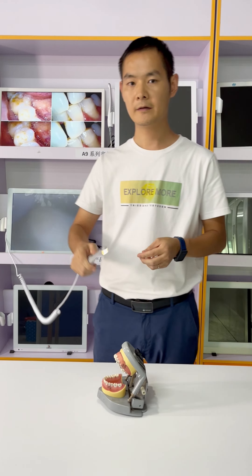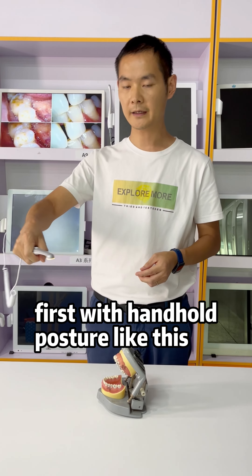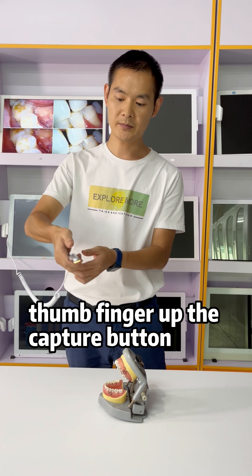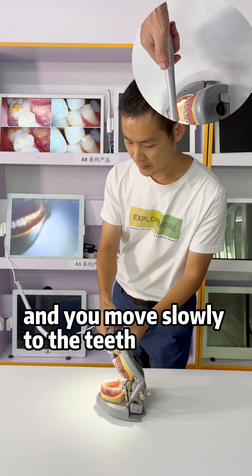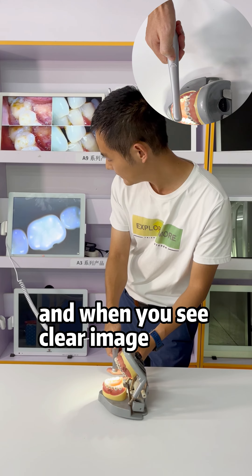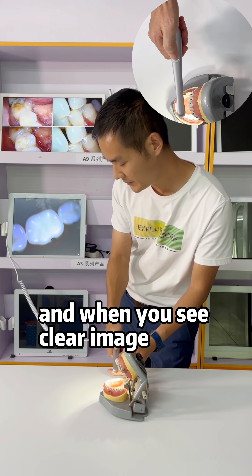When you take photos, there are two ways to handle the camera. First, it's a hand-hold like this, and with your thumb finger on the capture button, you move slowly to the teeth. And when you see a clear image, you slightly touch it.